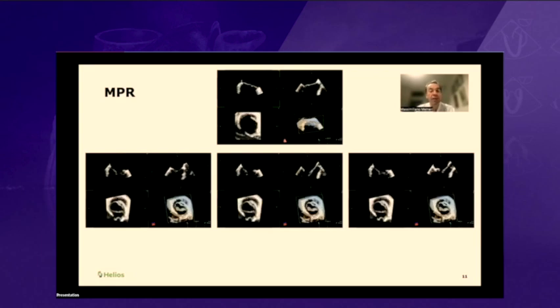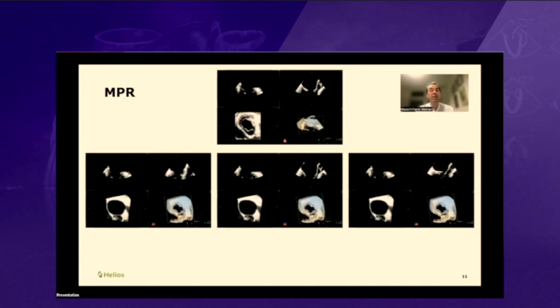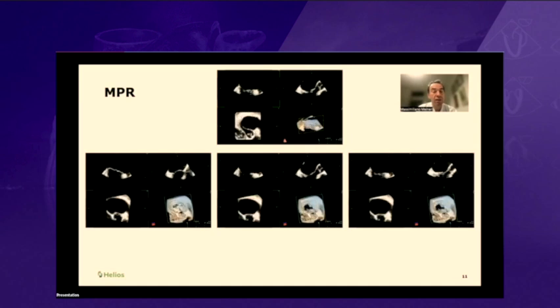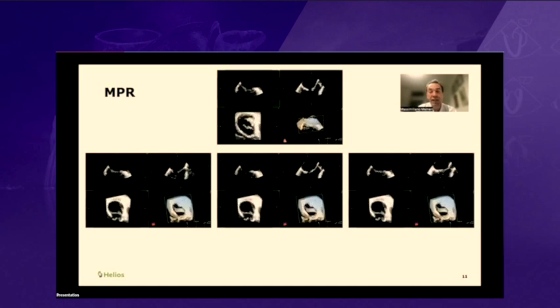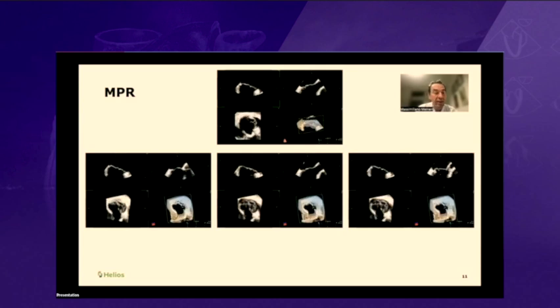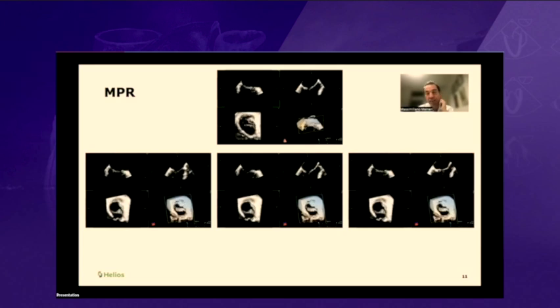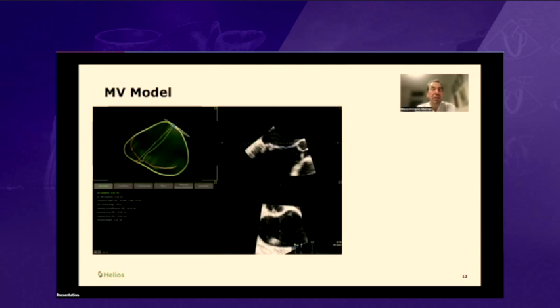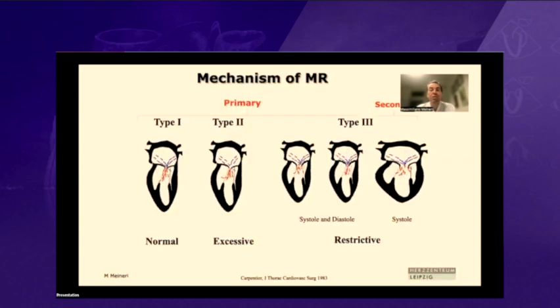I did offline analysis of this valve. Starting from more medially with MPR, you can appreciate the features: a restrictive short P3, prolapse in P2, and prolapse in P1. I also did an offline mitral valve model to confirm my findings. As I mentioned in my other talk, we don't use this on a clinical basis in the operating room — if there's time I do it and show it to the surgeon, but we don't use these measurements for decision-making.